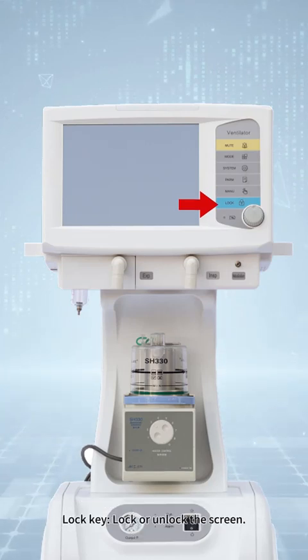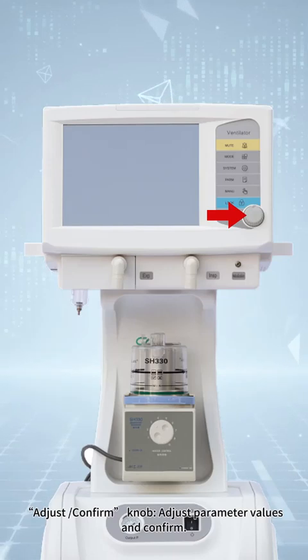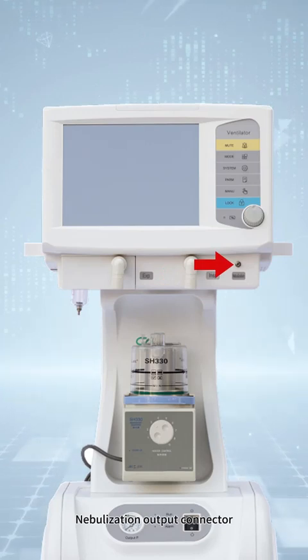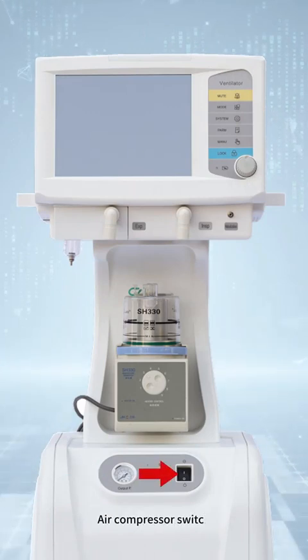Lock key, lock or unlock the screen. Adjust and confirm knob, adjust parameter values and confirm. Exhalation port. Inhalation port. Nebulization output connector. Humidifier. Output pressure gauge. Air compressor switch.